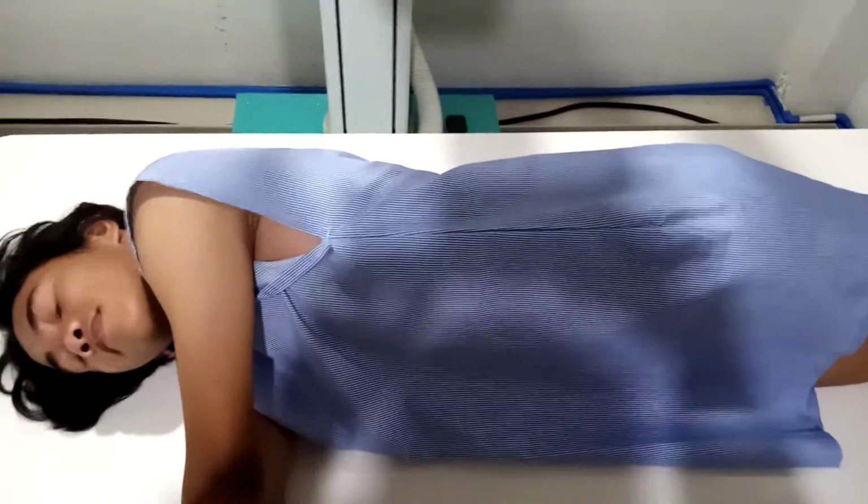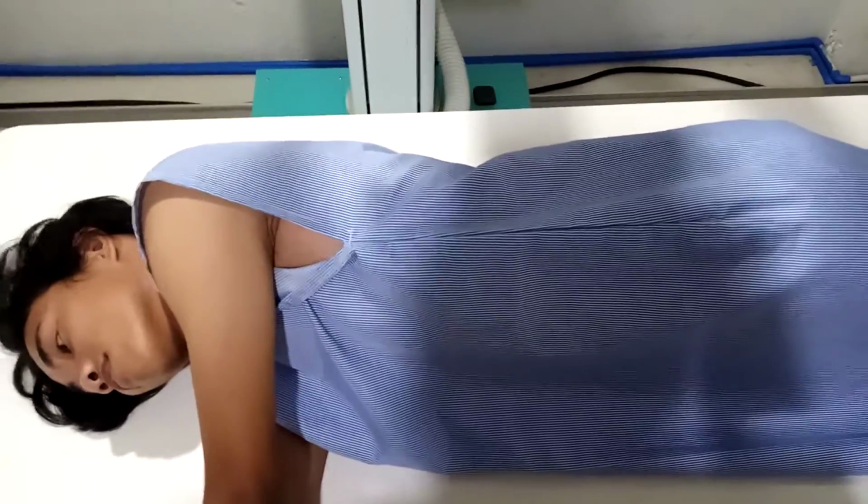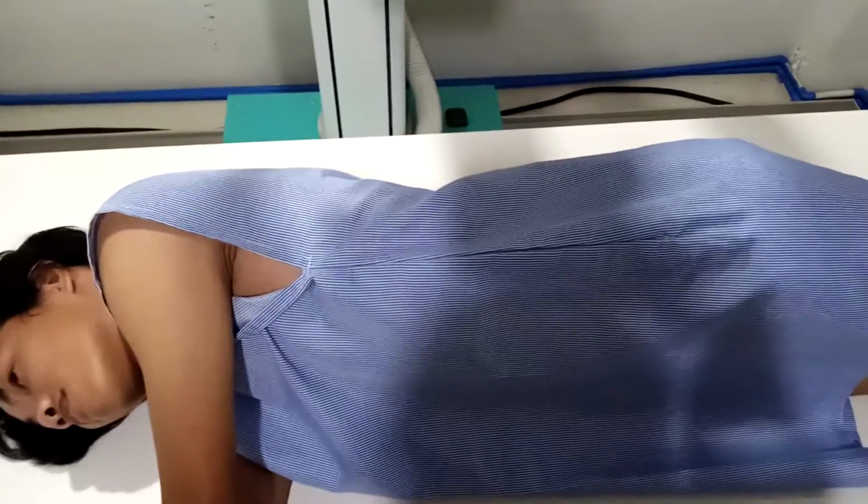And that is our lateral recumbent position. Then, in part positioning, center the posterior half of the thorax to the midline of the grid.